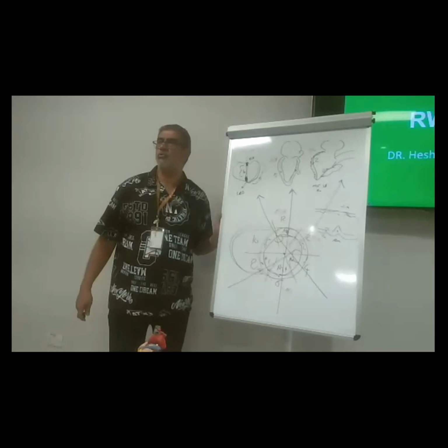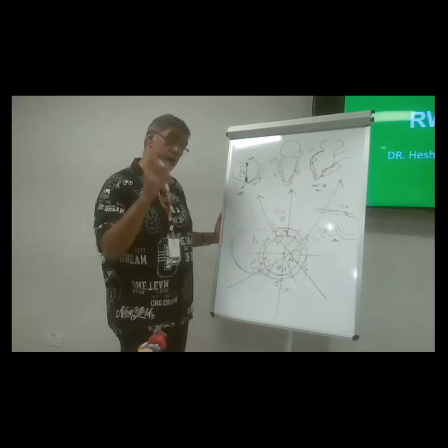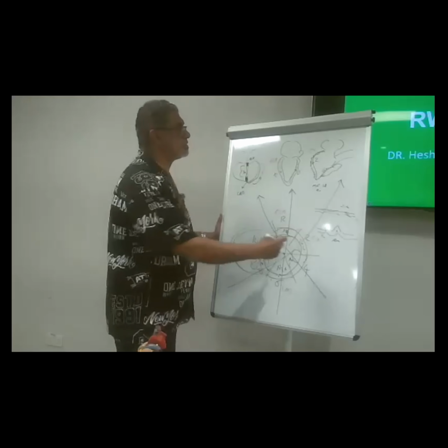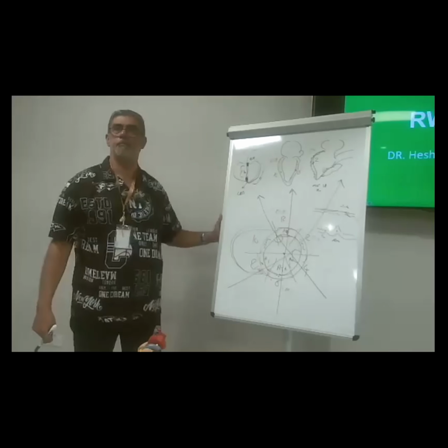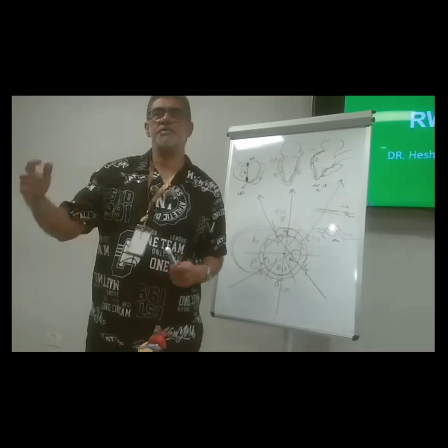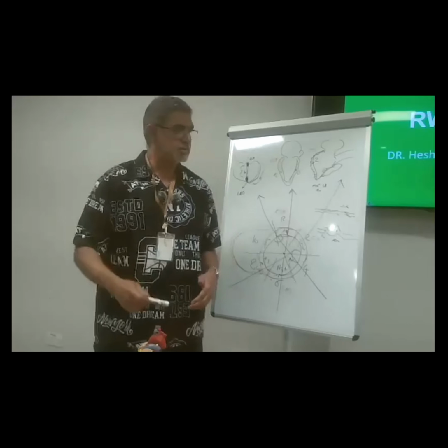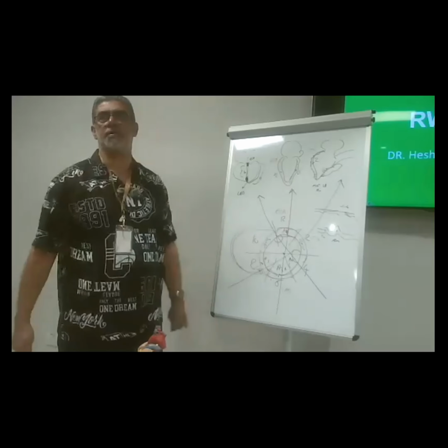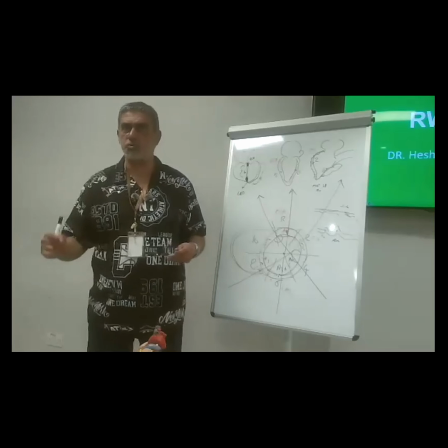Area number 2 is hypokinetic. I cannot report this until I confirm it. Area number 2 is hypokinetic, really. So I prepare myself to give the surgeon this red flag in his chest, telling him that this anterolateral wall is hypokinetic, because he knows what it means.